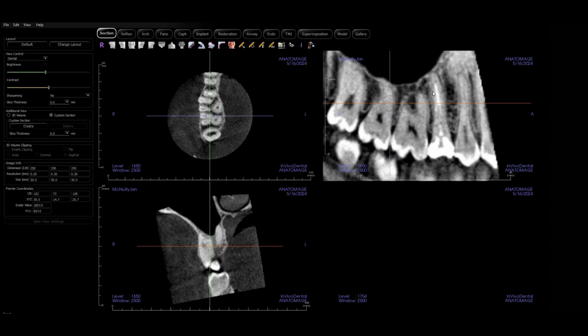So lack of memory is a good thing when it comes to files, but even still, because it's rotary, it's hard to keep that pre-curve or that modification to the K file where you want it. So sometimes we have to do what you did, which is to hand file with a 0.02 taper K file. It is what it is. It sounds like you were able to get to where you needed to go. So now you're at proper length.